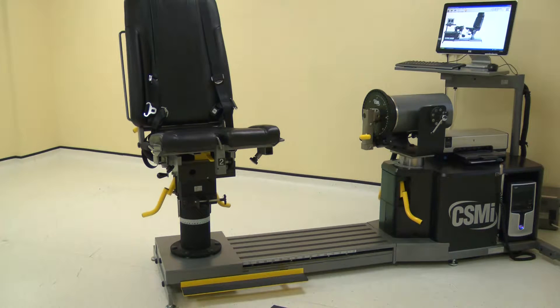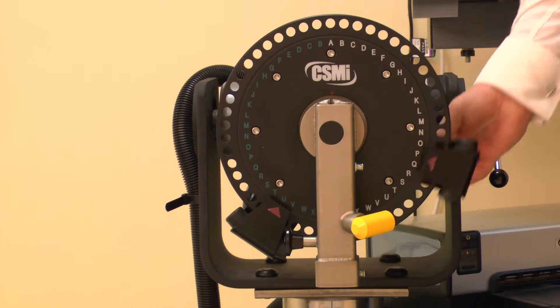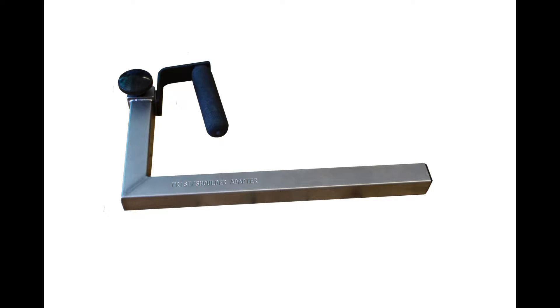First, ensure all of the adapters and stabilizers are removed. Move the first dynamometer stop to position E on the wide scale. Now move the second stop to position T on the wide scale. Collect the adapters and stabilizers for this test.